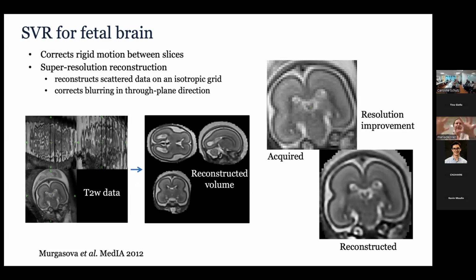Also when you have higher resolution when it reconstructs, it's easier to see all the edges and stuff like that. dHCP reconstructed even to 0.5. I mean, you can put anything you want, but it's kind of pointless because it's just interpolation really, because your data has the frequency it has, right?